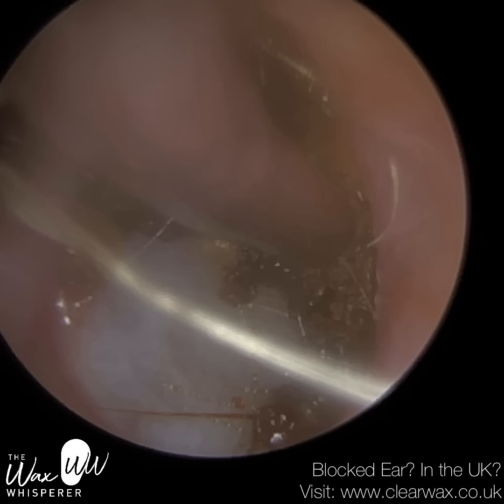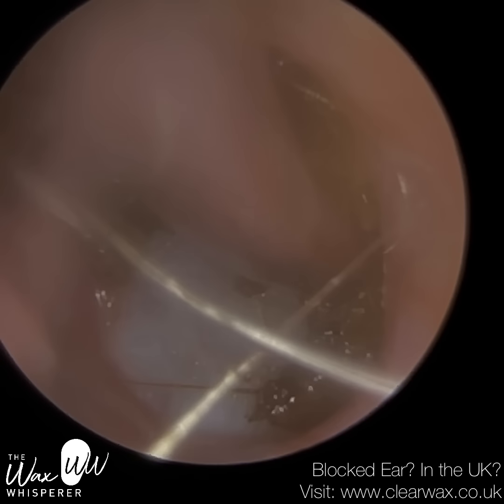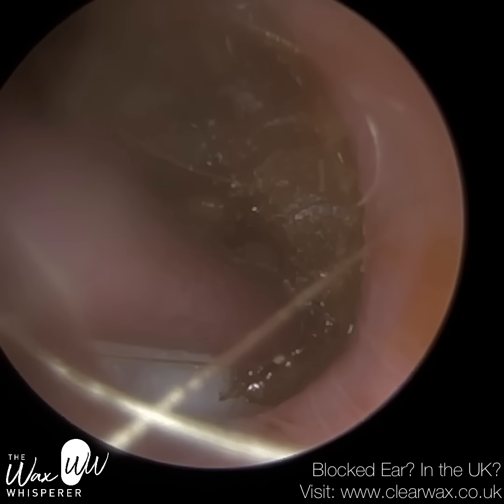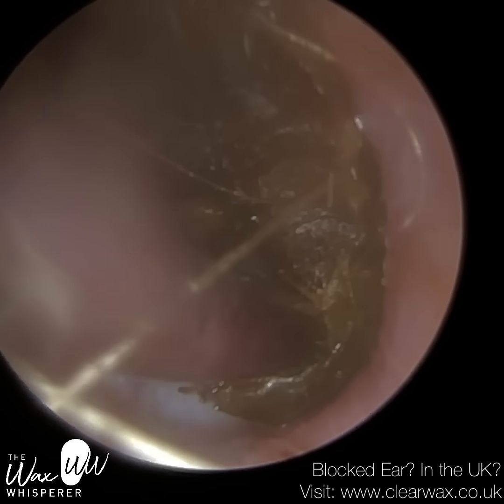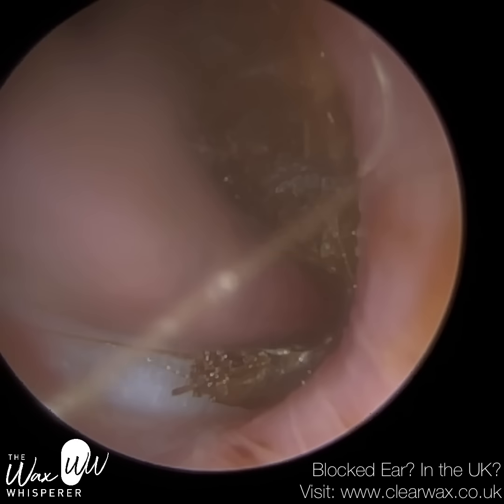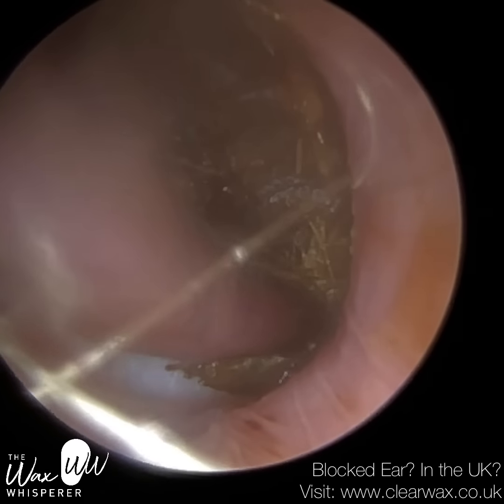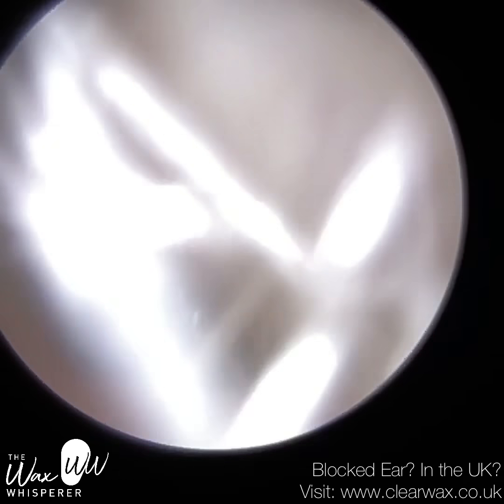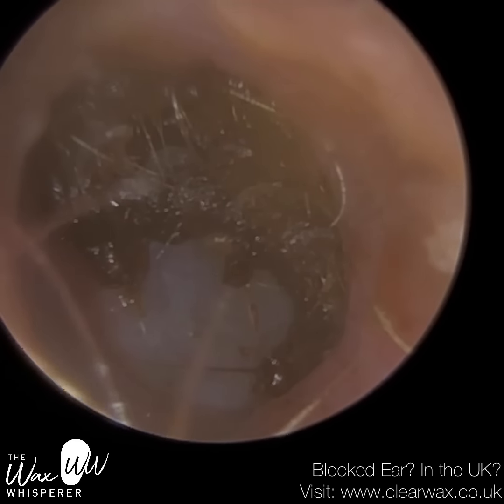You may have just seen that at the tip of the sucker — half the eardrum is now visible. The portion that's visible we call the posterior quadrant, which is the back region. I'm just trying with the fine end to manoeuvre this wax out. I'm now going into the inferior recess, trying to lift it up and away — it is moving, but it is still lodged. I'm going to go back in with the full Zollner suction probe as I need more suction power; the fine end just isn't powerful enough no matter how hard I try. I have got a suction grip, but it isn't strong enough to remove this from the anterior recess.